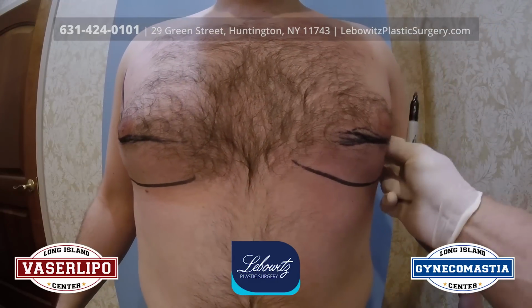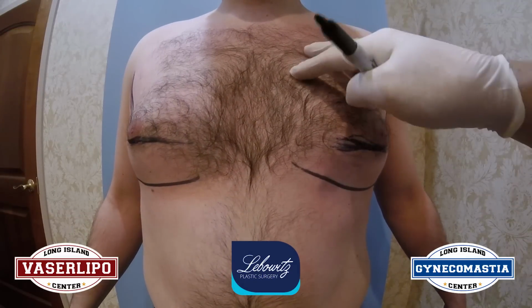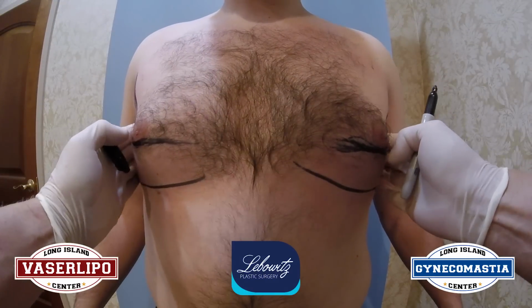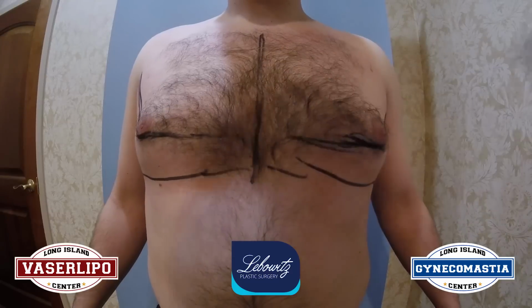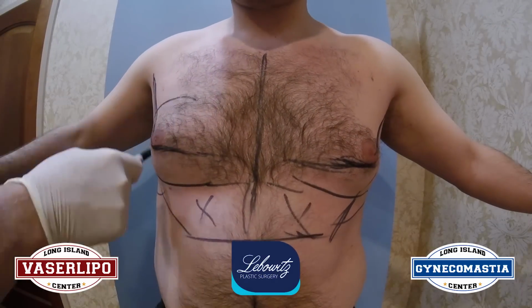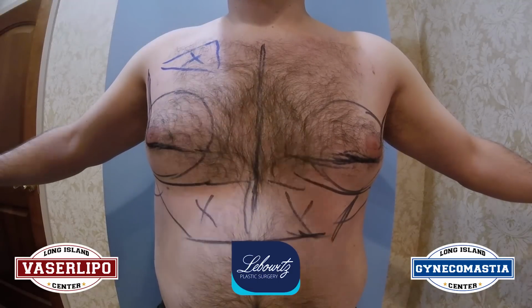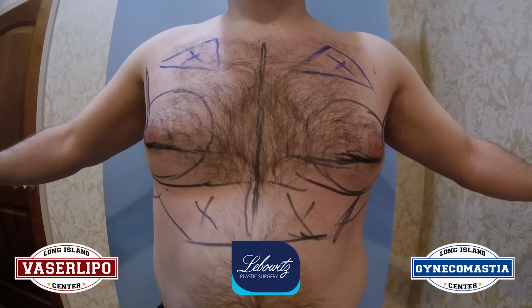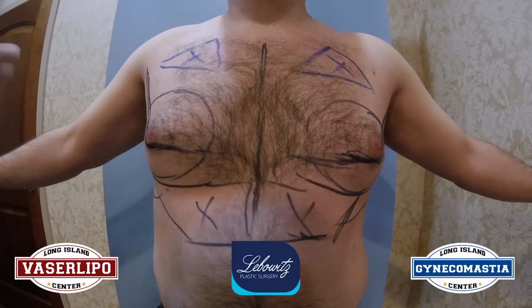High-definition physique is all about negative spaces and positive spaces. We want a nice full shape of his upper chest here, so we don't do much liposuction, so he's got a semblance of a great muscle, but we want a negative space here and a negative space here to really fine-tune his chest. We want to keep the shape here. This we want to keep. We don't want to make him too flat up here, because we want some bulk up there to give him a shape of his muscle. Make a sad chest into a happy chest, and that's what we're going to do.